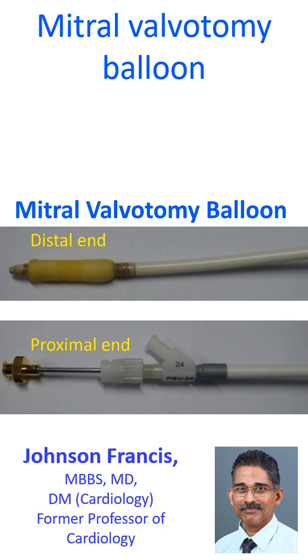The proximal end of the mitral valvotomy balloon displays the balloon size — 24 in this case. The size of the balloon required for an individual is calculated from the height of the person. Height in centimetres is divided by 10, and 10 is added to the quotient to get the size of the balloon needed in mm.